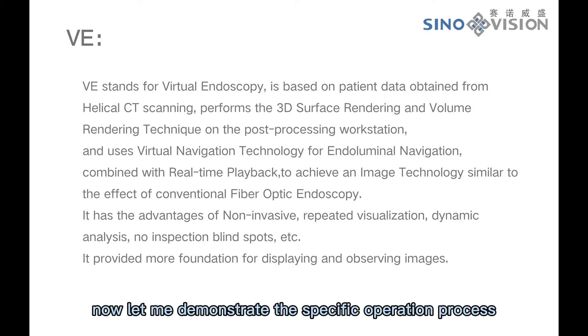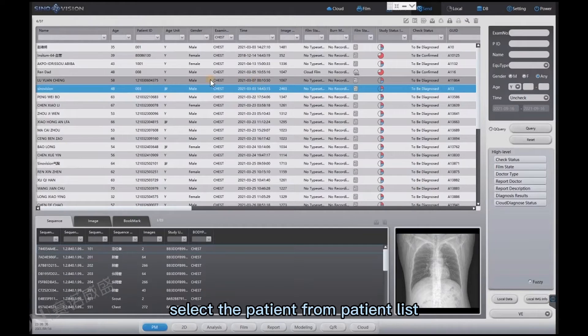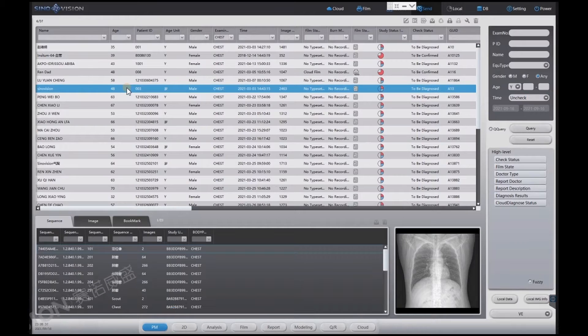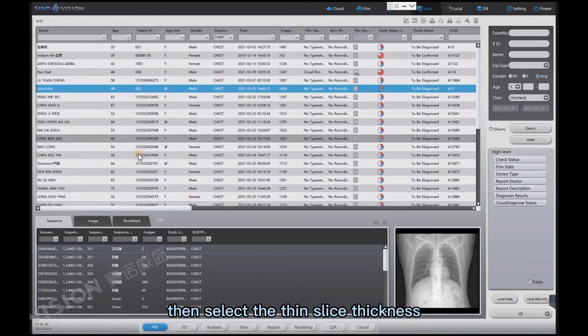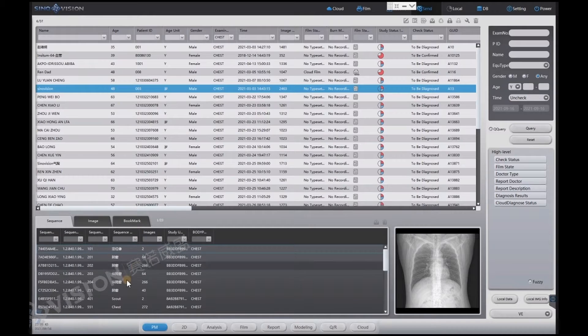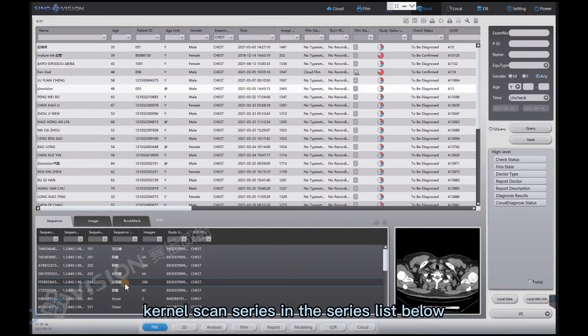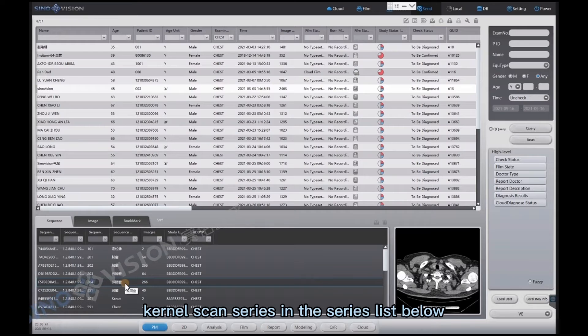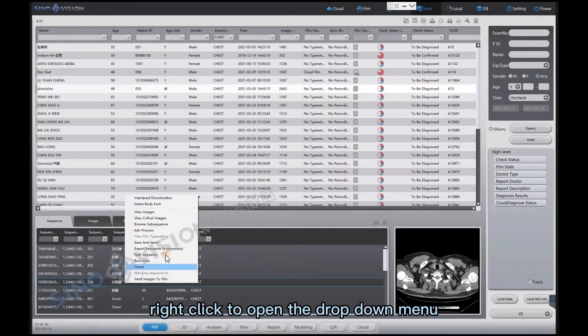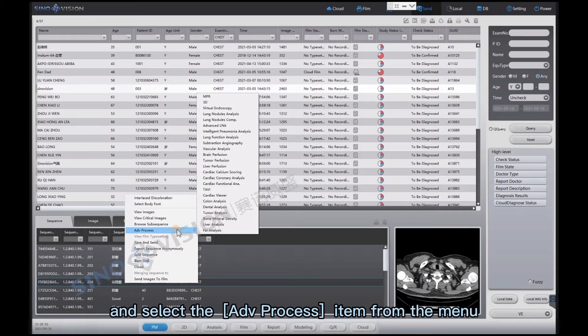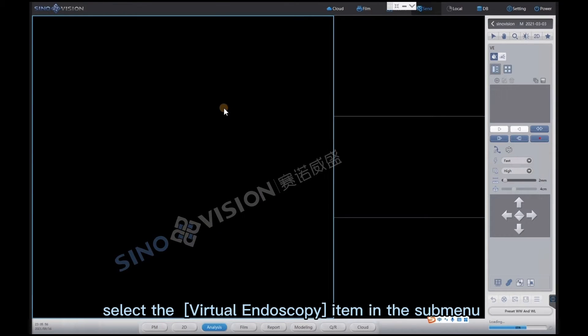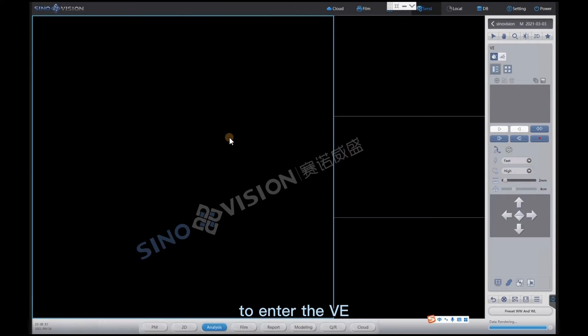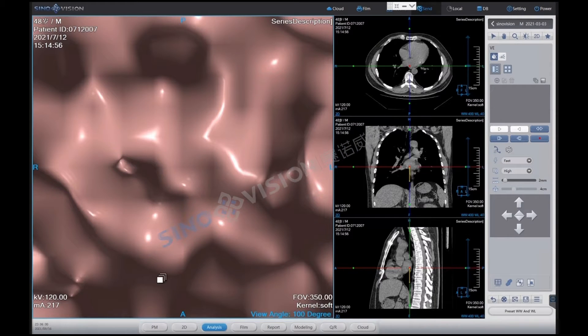Now let me demonstrate the specific operation process. Select the patient from the patient list, right-click to open the drop-down menu, and select the ADV process item from the menu. Select the virtual endoscopy item in the sub-menu to enter the VE interface.